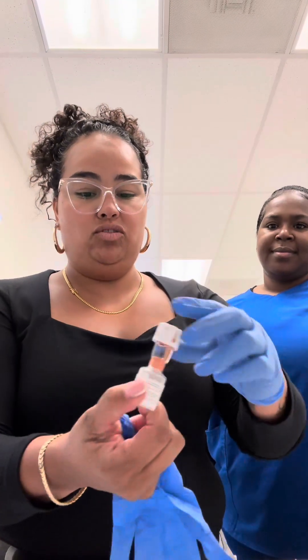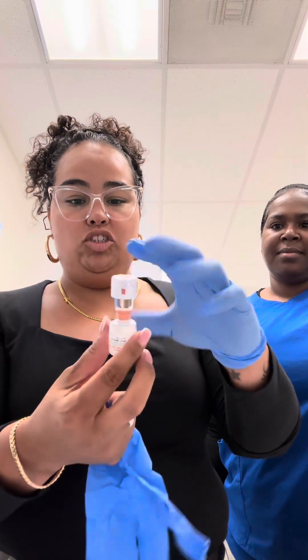We're going to take this opportunity to teach on how to draw up Solu-Medrol, which is a steroid. I'm going to show you how these little vials open up as well. First thing you want to do is glove up — most important. They have little caps right here, just pop them out.